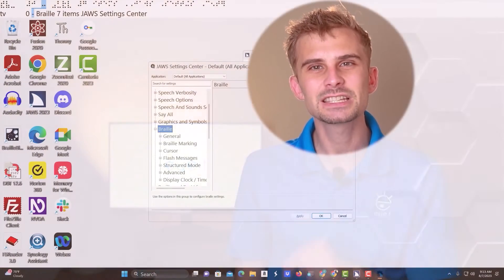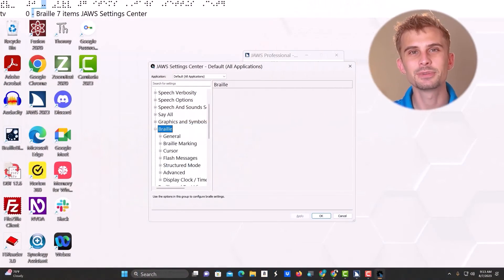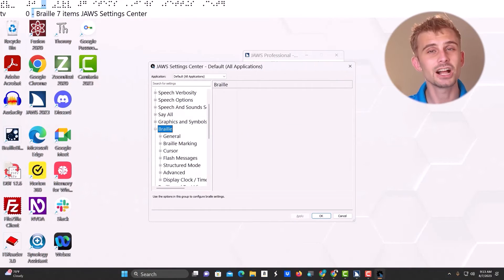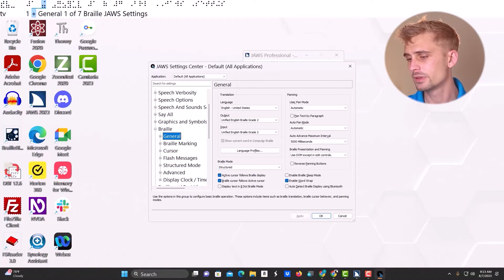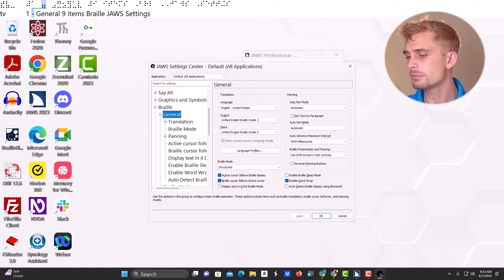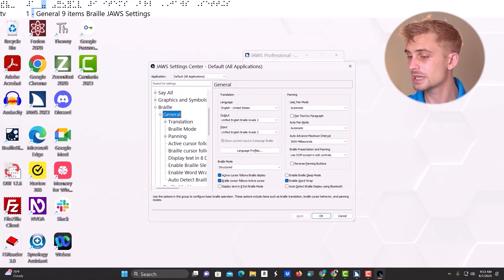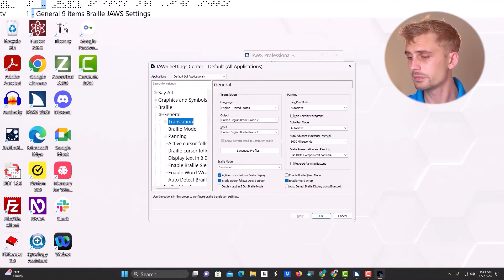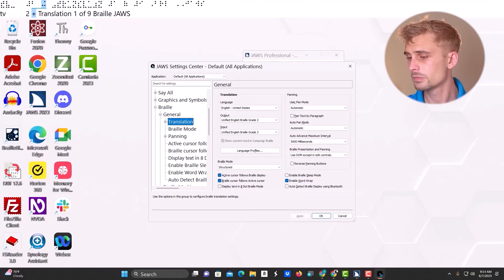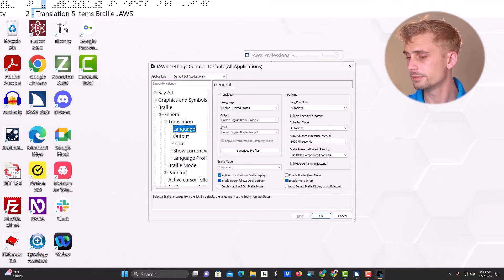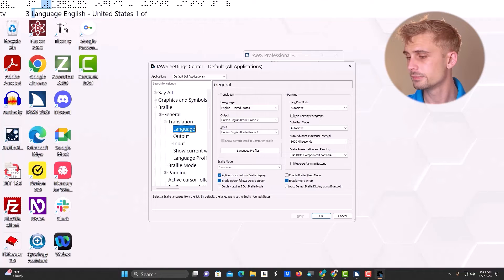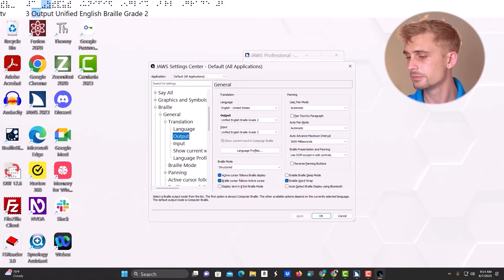Alright, so to change my display settings from contracted to uncontracted braille, I'm first going to move down to general. Open that up. Move to translation. And then move to output. Now, output is the braille that is actually shown to your learner on their display.